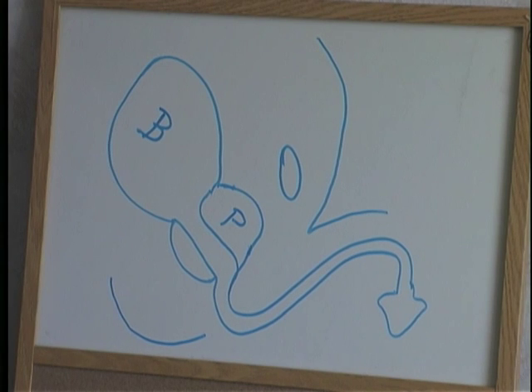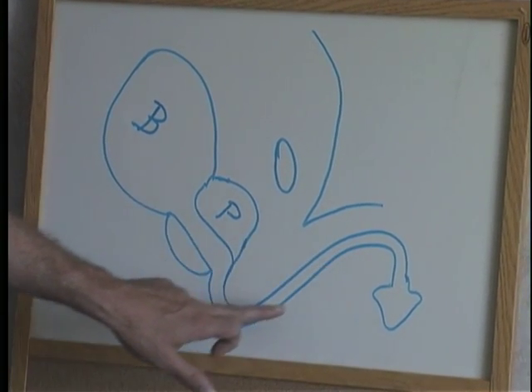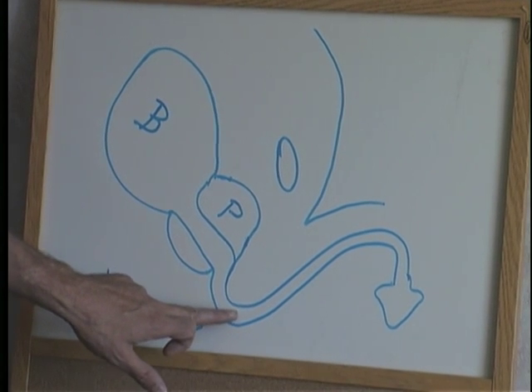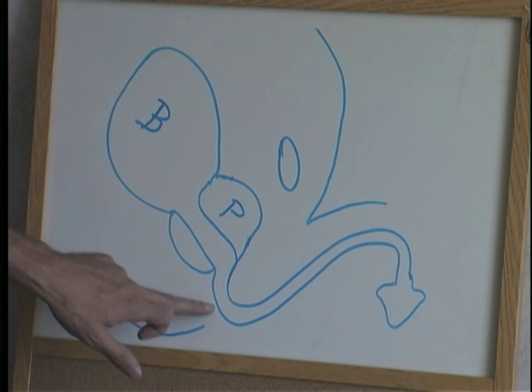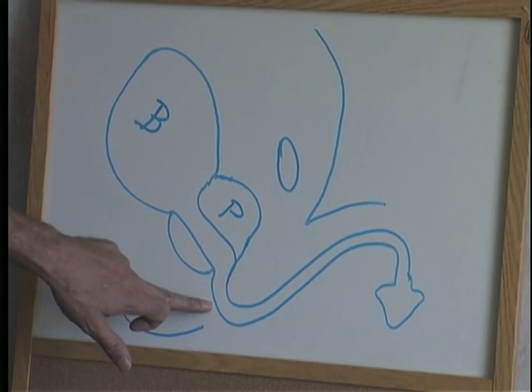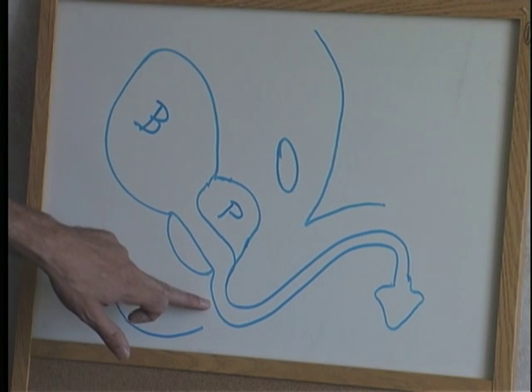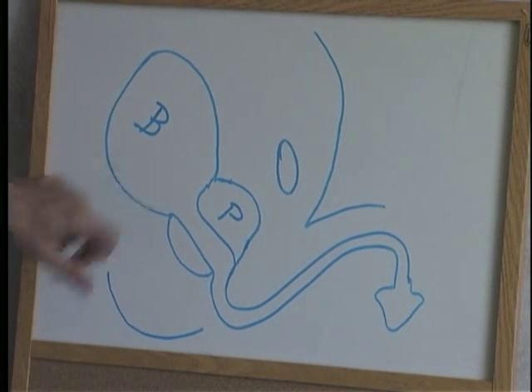It's at this point that complications with Foley catheter insertion can occur. With the penis straight, a Foley catheter inserted from the tip will be able to manage this area of the urethra. In the level of the bulbar urethra, the urethra takes a significant curve anteriorly towards the umbilicus prior to entering the prostate gland and then into the bladder.